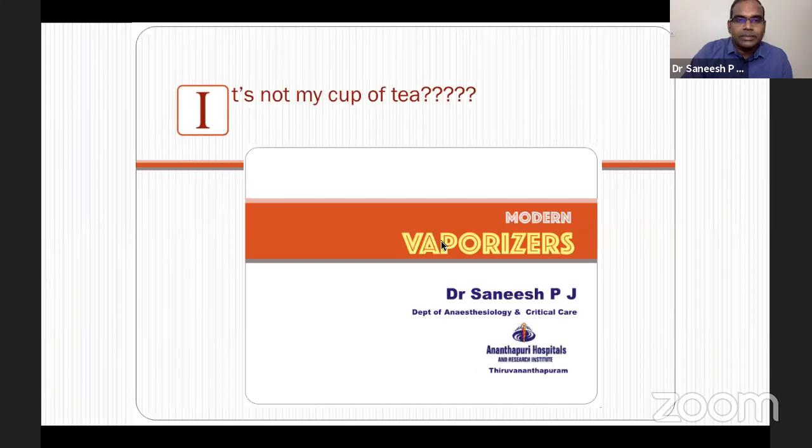So somebody is saying some question is not answered. Desflurane is only for Tec 6. In the injector vaporizer, thermocompensation is mostly by the supplied heat.